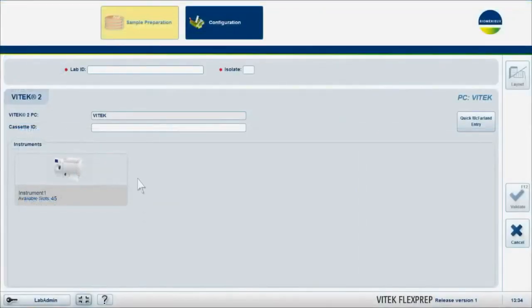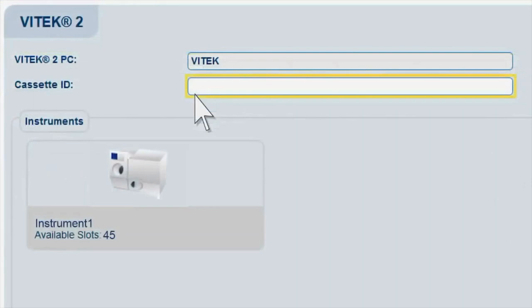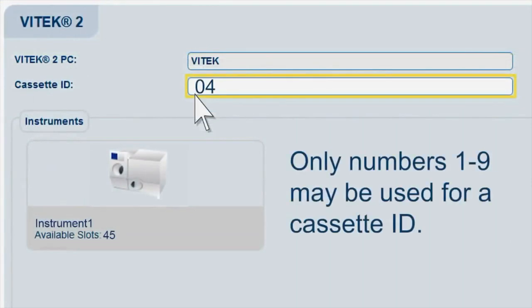Click in the Cassette ID field. Enter the desired cassette ID for the cassette in use and press Enter or scan the barcode located on the cassette. Only numbers 1 through 9 may be used for a cassette ID.